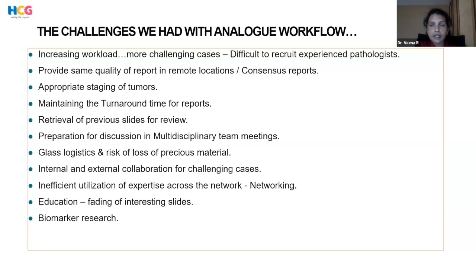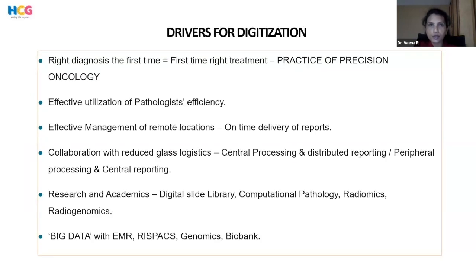And as I said, we are an academic institute, so using the digital slides for education and biomarker research was another thing that motivated us to adopt digital pathology. So the drivers for digitization for us were basically the practice of precision oncology, where we had to make the right diagnosis the first time so that the patient gets the right treatment the first time in the management of cancer.